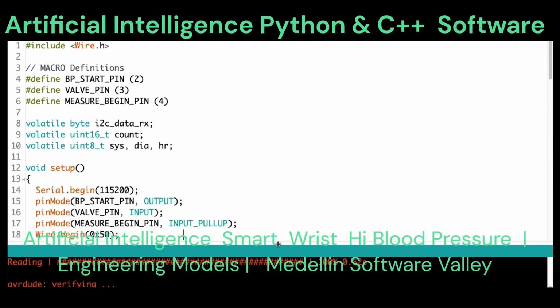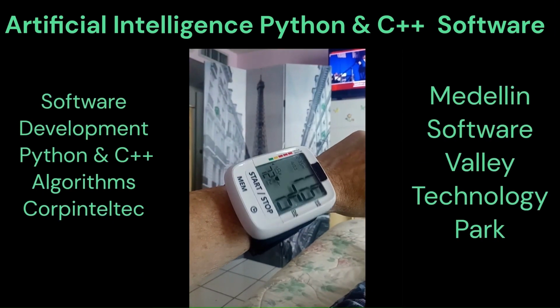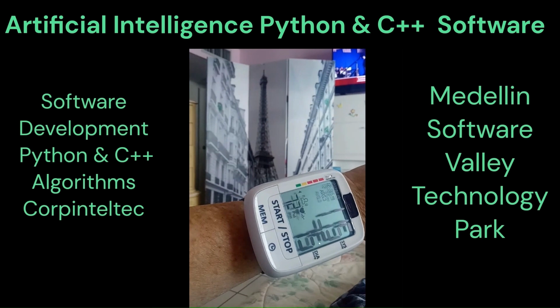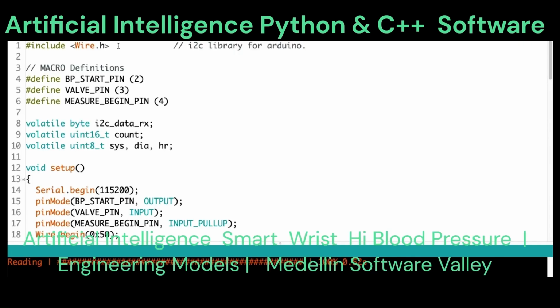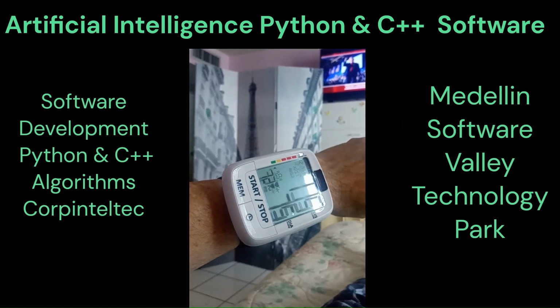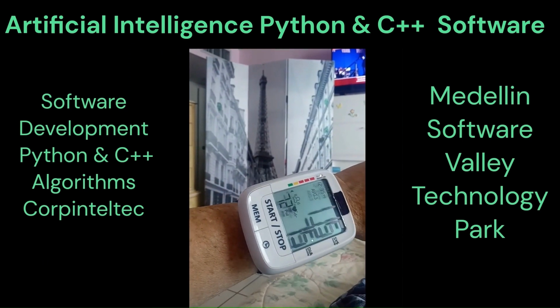The ring-shaped band can be worn on the user's wrist with an air pocket inside the annular band that applies pressure. The ambulatory blood pressure of the user is measured by a pressure sensor that detects the air pressure inside the air pocket and measures the blood pressure waveform.